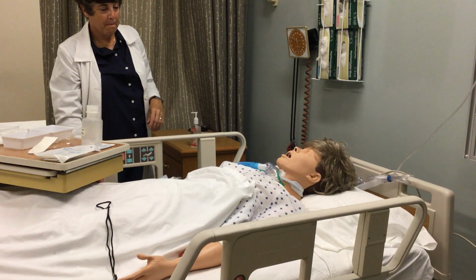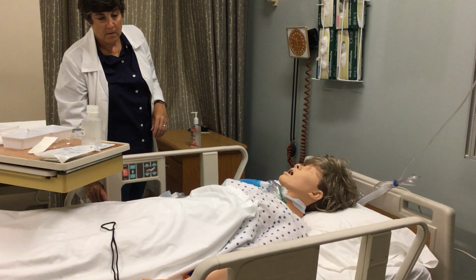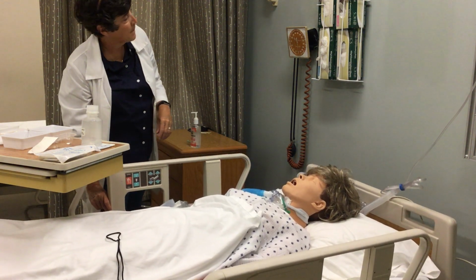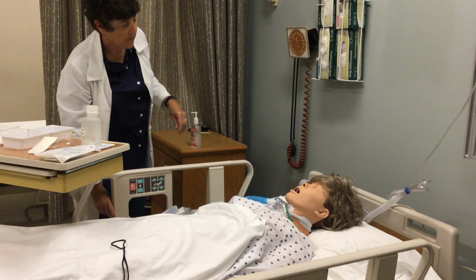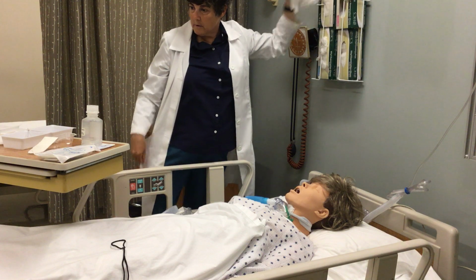Dispose of used supplies and equipment. Leave the patient's room tidy. Remove and dispose of gloves and perform hand hygiene. So put on another pair of clean gloves just to clean up all this mess.